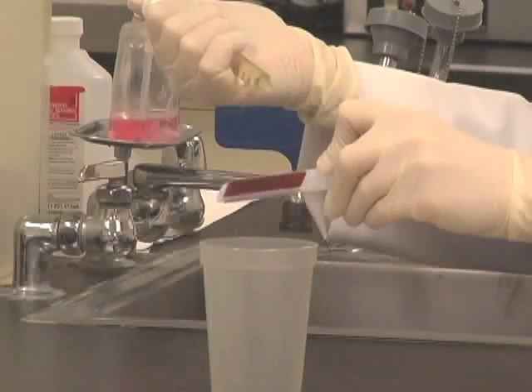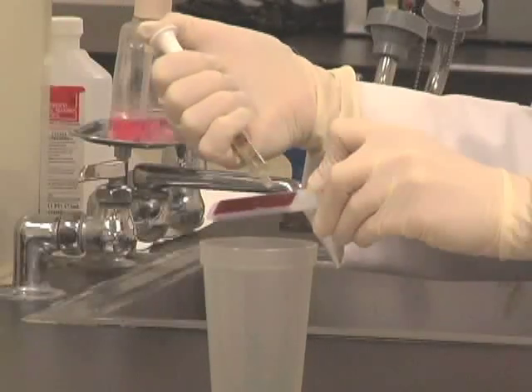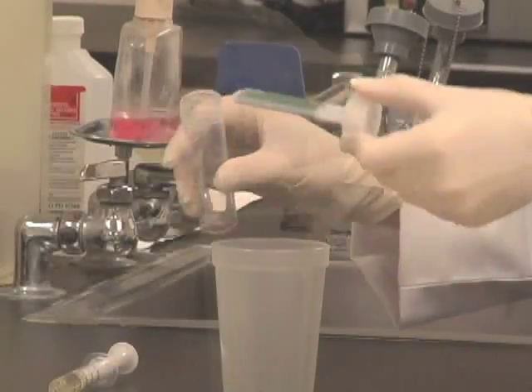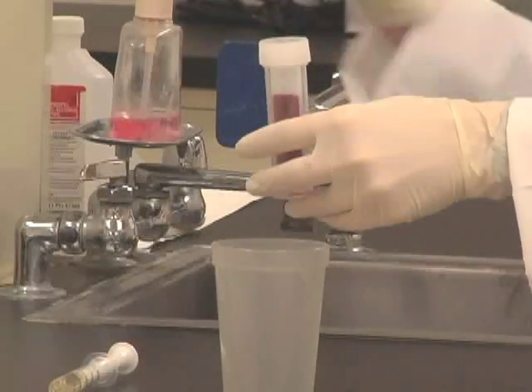Next, hold the syringe containing the specimen over the Uricult VET paddle and apply a few drops of urine to both sides of the paddle. Make sure that you completely coat both sides of the media. Then, place the paddle back into the plastic vial but turn the cap only loosely to allow air to circulate. When you're done, be sure to label the vial appropriately using the label supplied in the kit.